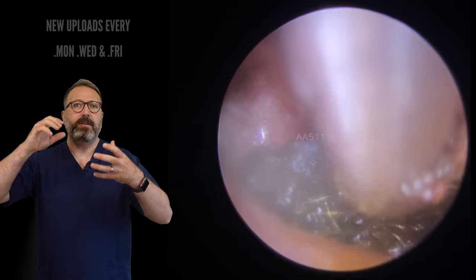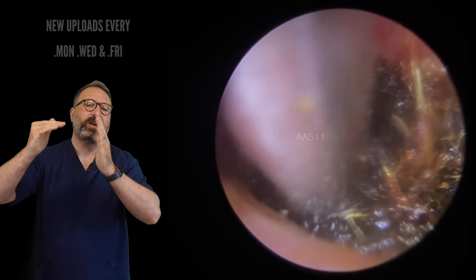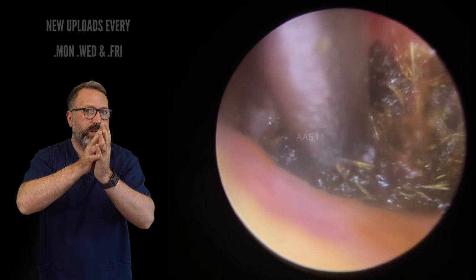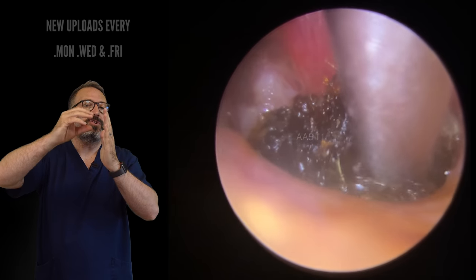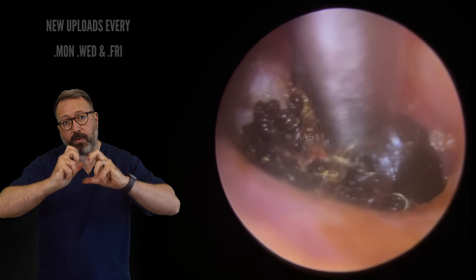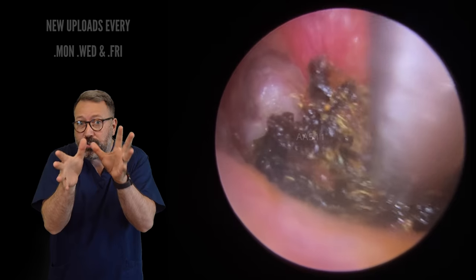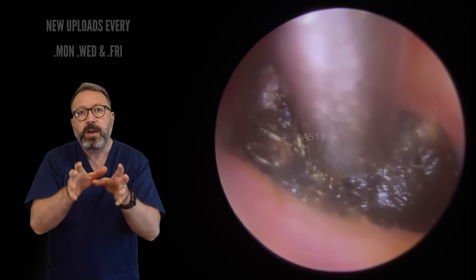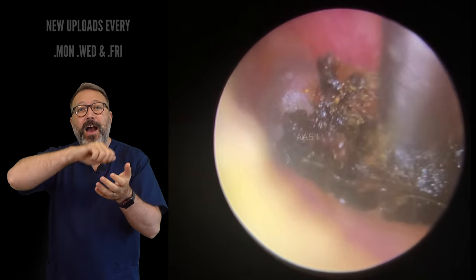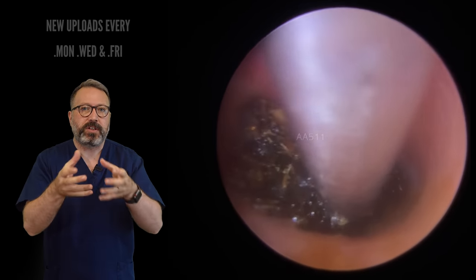What I'm doing here is — because I can't get a Jobson horn in there, as it's right on top of the eardrum — the Jobson horn is only really effective if you can get behind the wax and draw it forwards. You could chunk bits off the front, but it's going to press that even further against the drum, which is going to be really uncomfortable. So what you could see me doing was using the side of the suction tube, starting at the top and just drawing the suction tube very slowly down the front. The suction is helping to pull the wax, and the side of the suction tube is actually starting to loosen it. And now look — we're just starting to get a little bit of movement. It's just getting a little wiggle to it, so it's freeing up. We've managed to detach it from those canal walls, and moving it in circular motions to loosen it all the way around. That also helps to work the olive oil underneath it, which is going to help it to slide.